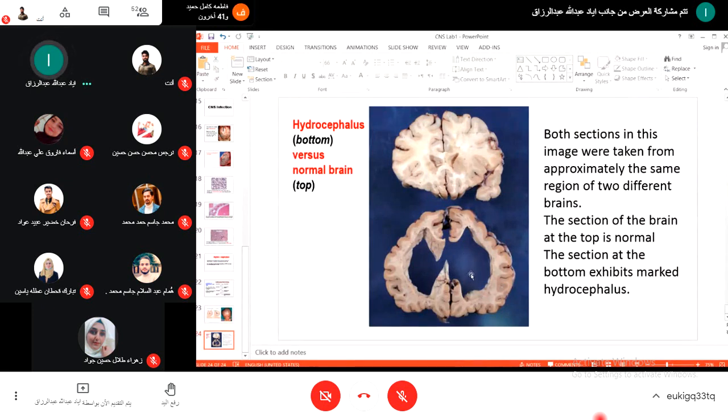لاحظوا هنا الفرق بين هاي الصورتين. زين. هذا النورمال برين وهذه الهيدروسيفالوس. هذه هيدروسيفالوس وهذا النورمال برين.